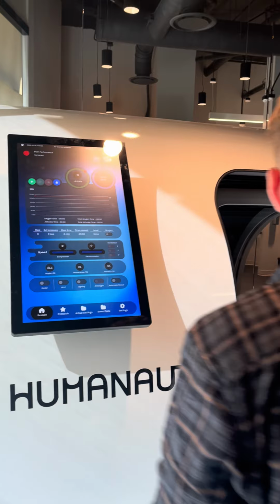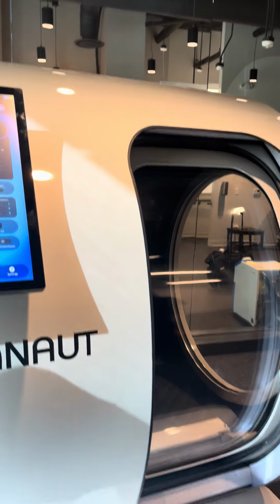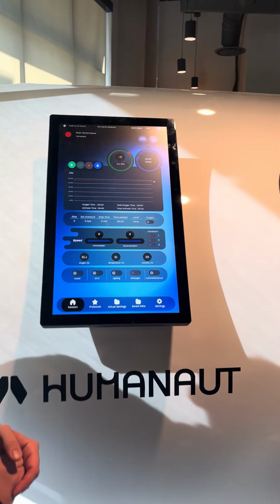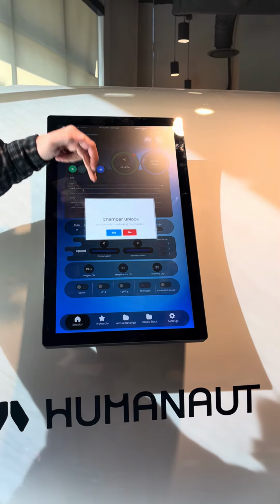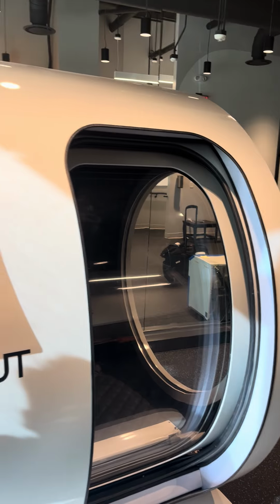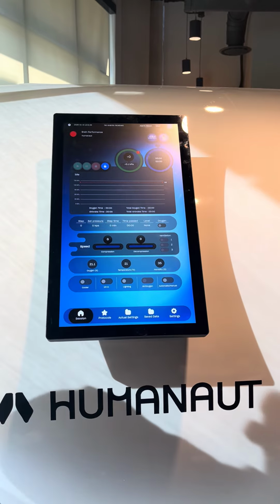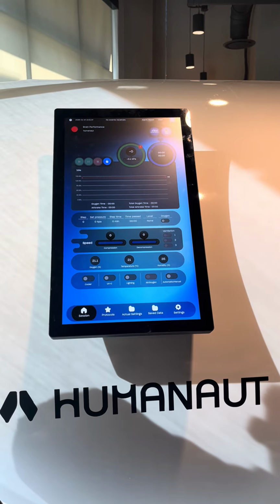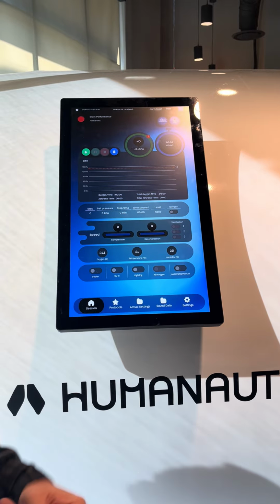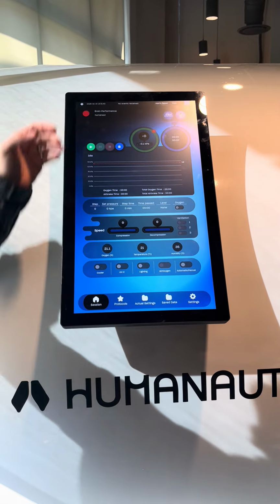Saw that the door didn't close because the compressor was closed at the time. Alright, so we're gonna go ahead and unlock the door one more time. Lock it again. Alright, you wait until you don't hear the door hissing anymore, and then press play.